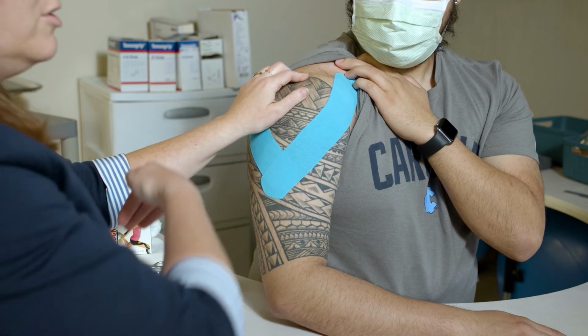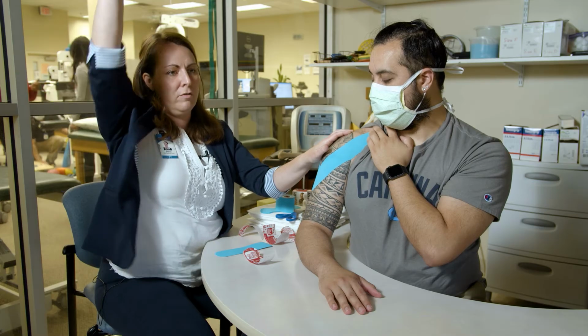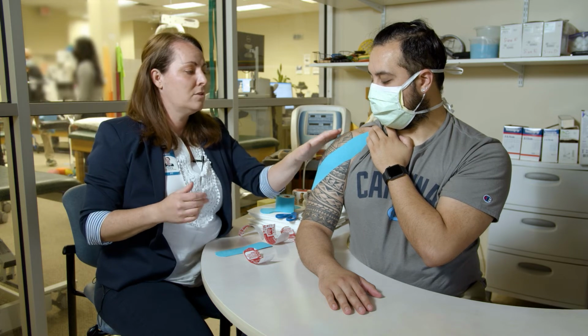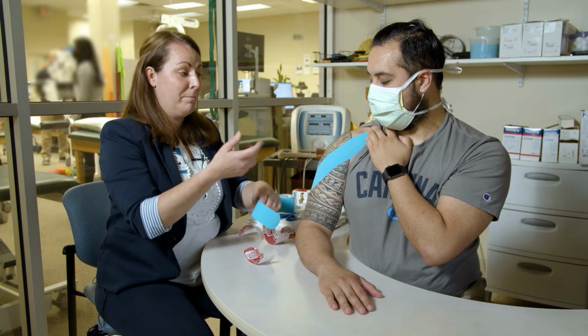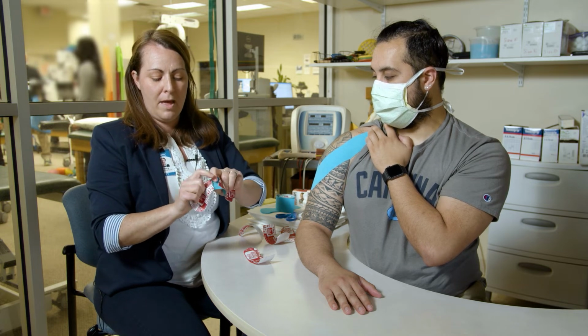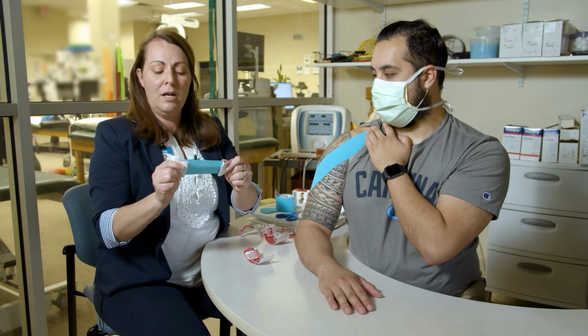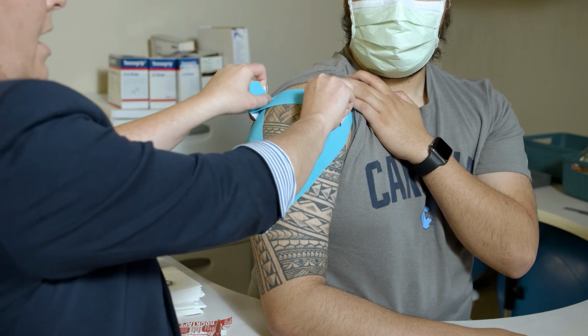This is where he points to at the initial evaluation and says, ooh, this hurts right here. Anytime I reach overhead, this is where my pain is. So what we're gonna do here is we're gonna do a decompression strip there. I'm gonna rip the tape down the middle, and then I'm gonna pull it just enough. We don't have to do a big pull, just a little pull right over that segment.